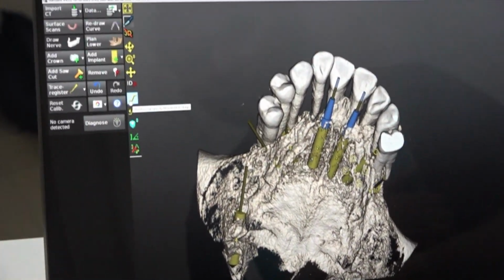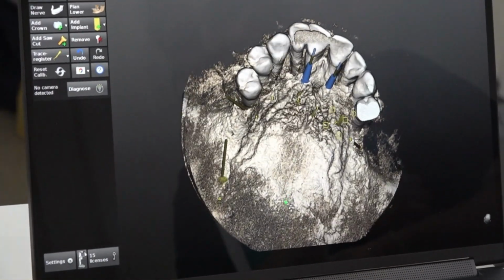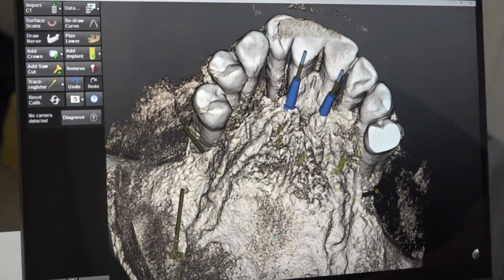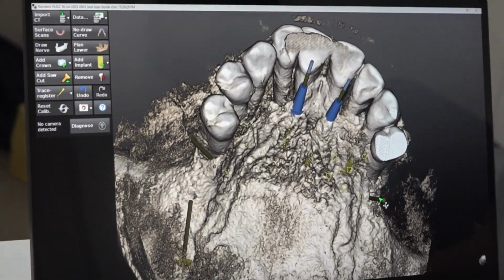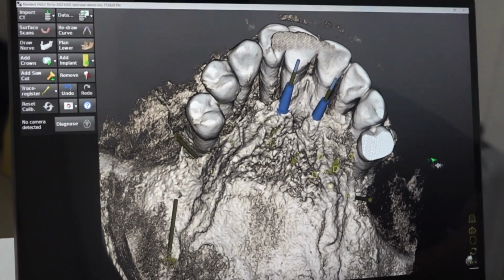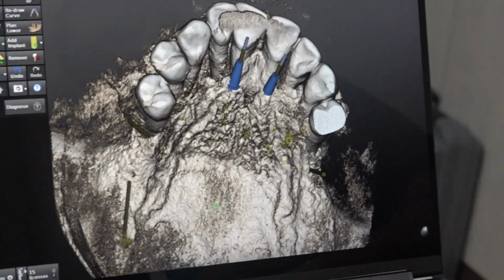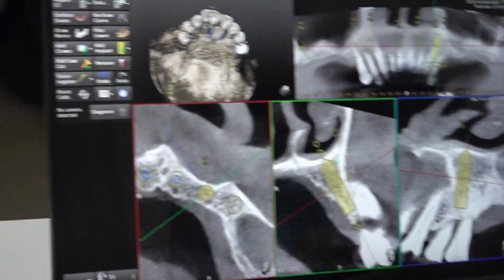You have to modify this. You may feel, no, the entire implant is outside the bone, and this is the starting point. So this implant from the 2-5 area we are tilting towards the buccal. This canine, almost we are going along the apex of the canine. Okay, right?